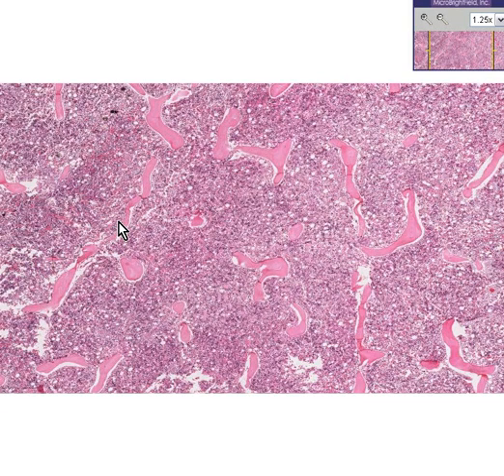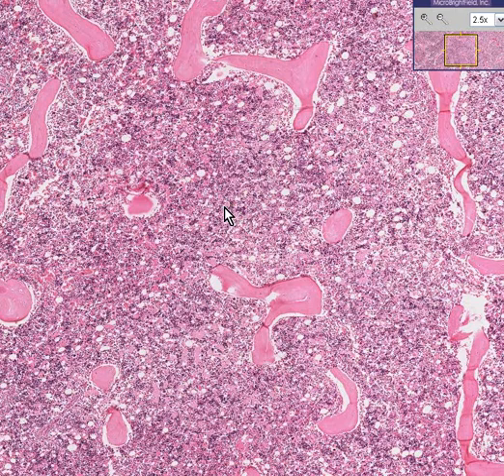This slide you're going to have to take a little bit on faith, but let's break it down. Here's another bone. You could see the spicules again, and you could see a lot of bone marrow between the spicules. If you remember, we said in general, even red marrow or hematopoietic marrow is about 50% fat. I think you'll agree that the fat here is just a very small percentage of the hematopoietic marrow, perhaps 10%.